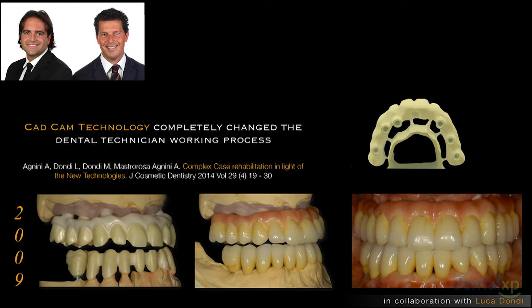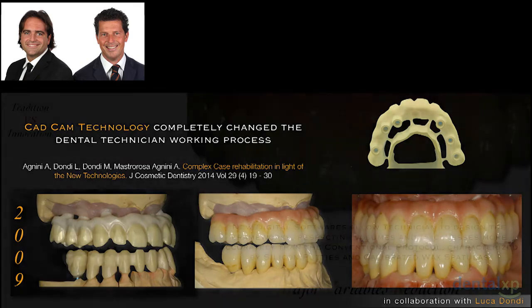Notice the excellent work done by the technicians Luca Dondi and Matteo Dondi, carefully checking the occlusion first on the model and then in the mouth, where it has been possible to prosthetically compensate the third class, reestablishing the anterior guidance.